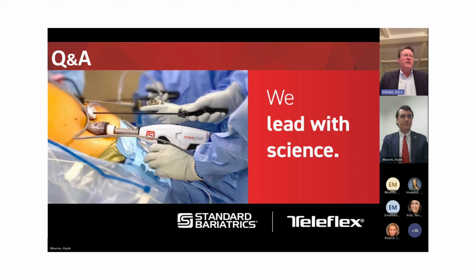Now, having said that, in our group, in the first 6 or 7 months, we were using the Titan R, and we switched over to the RB, which provided a little bit better compression after about 6 or 7 months. I would say our comfort level was better with the RB without a buttress material. So although the technique was easier to learn, our comfort level went up significantly when we had that better compression with a newer stapler model.